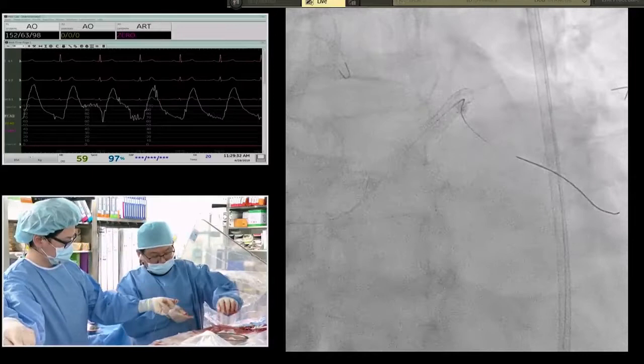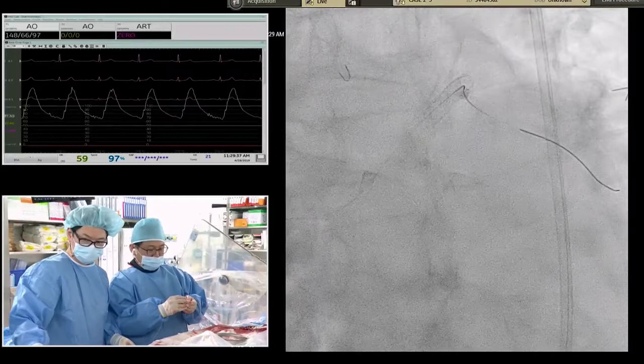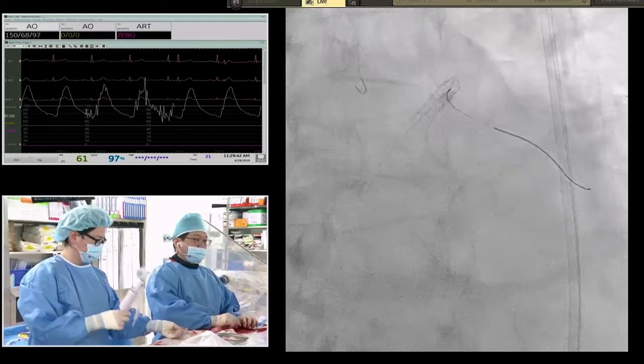I think that Cypher stent looked pretty good for 13 years. We didn't see it very well. I think they showed it okay. There wasn't that much neointima. I think it was a little under. Agreed. But they skipped through pretty quickly. I just like to look at it.